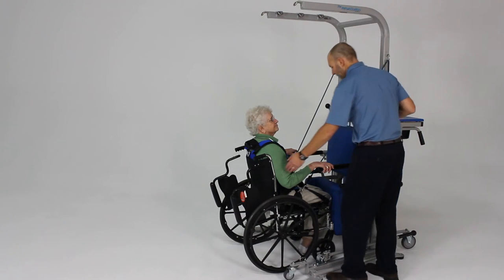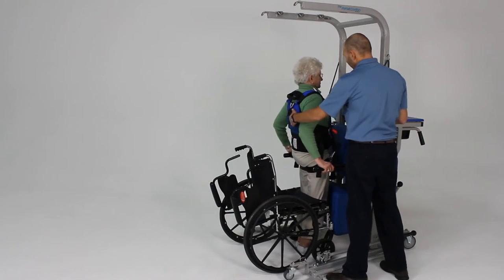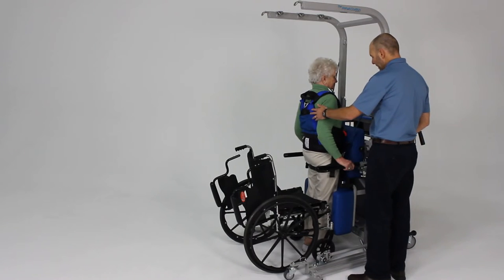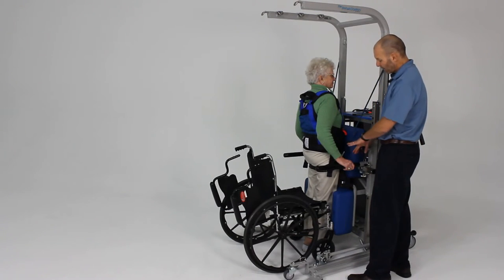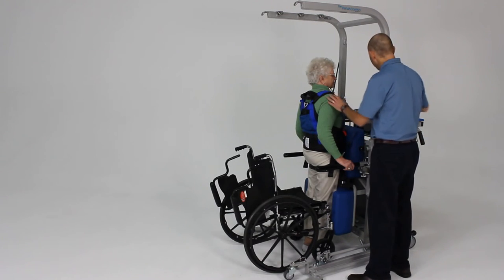We're going to go ahead and have her lean forward and stand up. Good. Now once she's in the standing position, come a little farther forward so your knees are against the pad. Now she's safely blocked at her knees. We can also add some support for the upper body if we want to at this point.